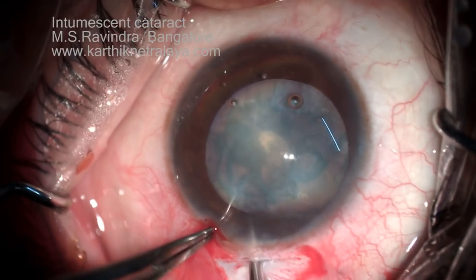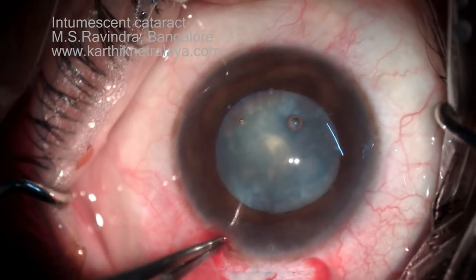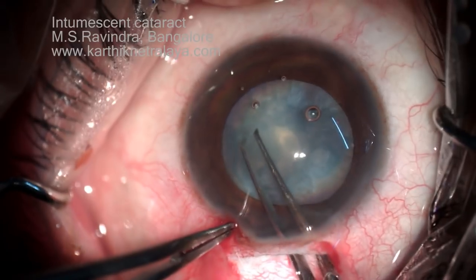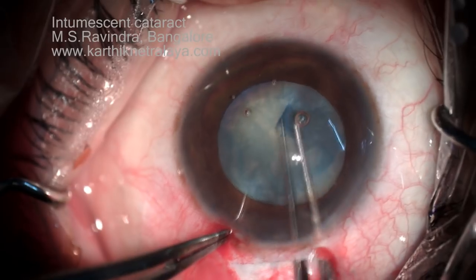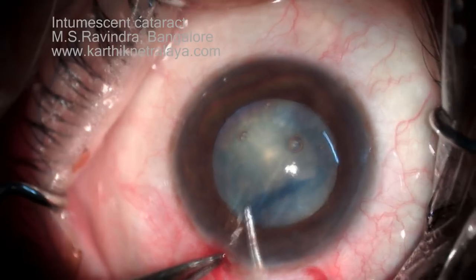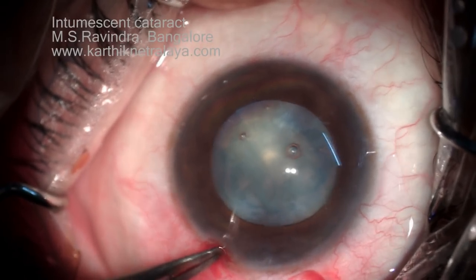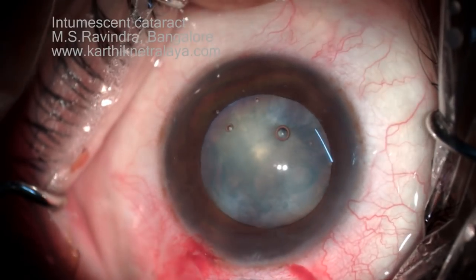With a cystitome, make a tangential cut on your left side, hold the flap and create a secondary rhexis. I realized that the nucleus is not very dense and not very large in size. So my aim now is to not lose the rhexis and complete it. It's a relatively small rhexis but I'm sure I'll be able to remove the nucleus through this very comfortably without putting a strain on the zonules.